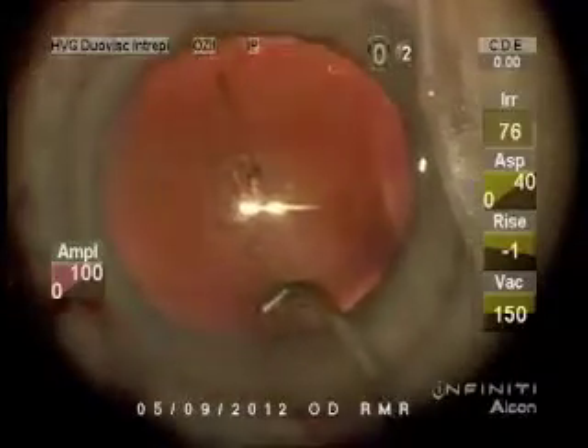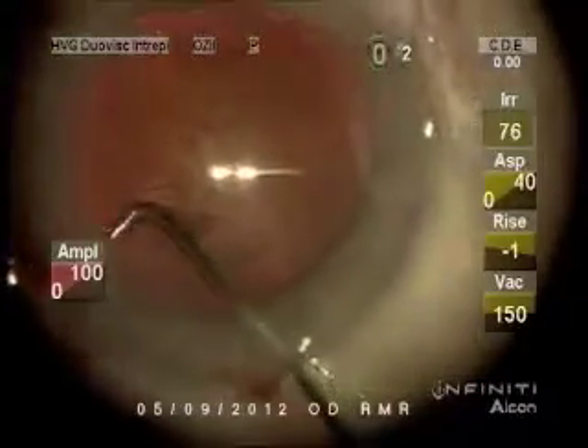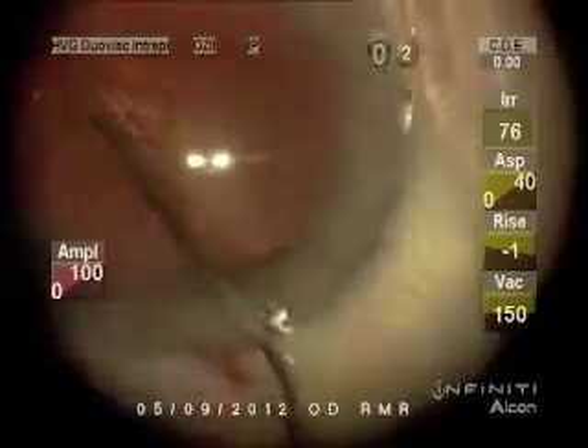This is a hydrodissection cannula that I continued to make for many years ago. It's 26 gauge. Dr. Chang is promoting one that's 27 gauge, but I find that the stronger stream is more effective for me.